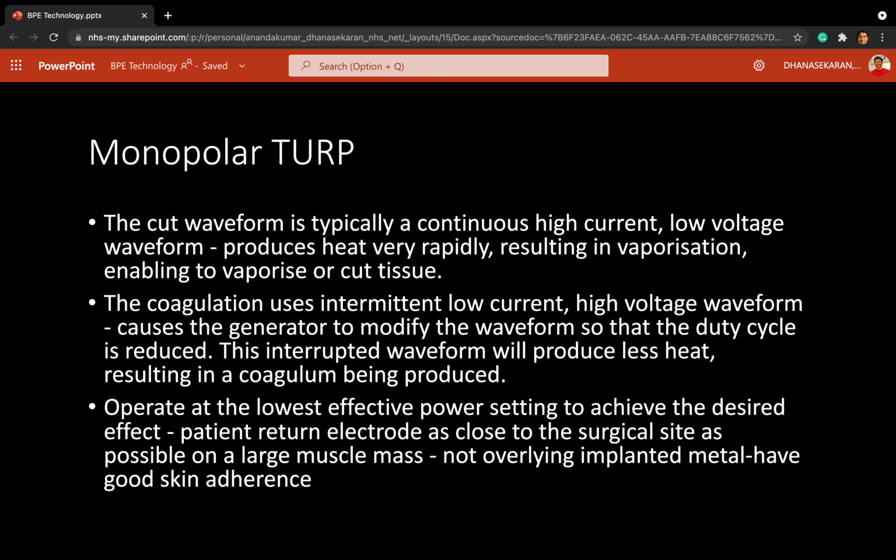The surgeries that the NICE guidelines recommend offering to him are monopolar TURP, bipolar TURP, monopolar transurethral vaporization of the prostate, UroLift, Rezum, and prostatic artery embolization, and also laser enucleation of the prostate. Okay, so how will you explain this to him? Say starting from monopolar TURP, how it works.